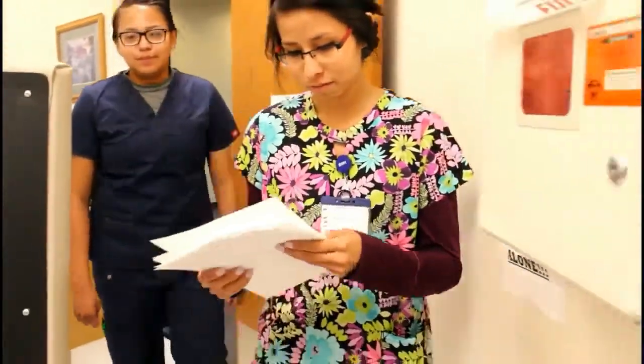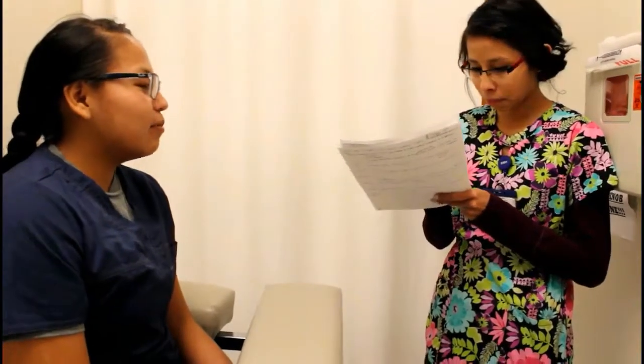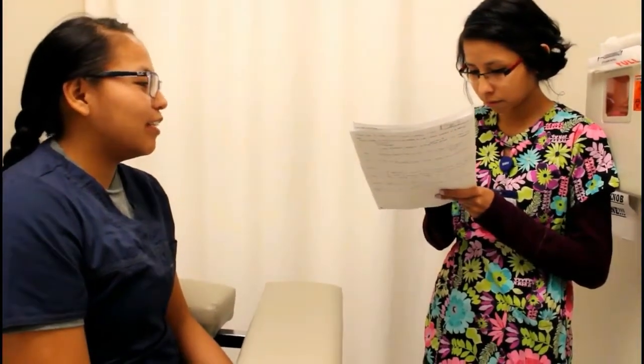Have a seat, please. Hi, my name is Kristen. I'm from the lab. I will be needing to draw 2 tubes of blood today. Is that okay? Yeah. Okay. Can you verify your name and your date of birth, please? Last name Long, L-O-N-G. First name Leah, L-E-A. Date of birth 12/26/95. Okay.